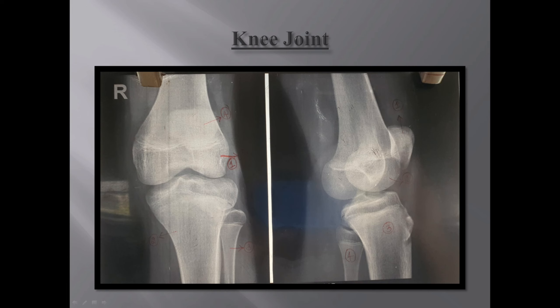Another important aspect to note in the knee X-ray is the joint space between the condyles. The joint space is inversely proportional to age — as age increases, the joint space decreases. We can also notice the epiphyseal line, indicating that fusion has not completely taken place.